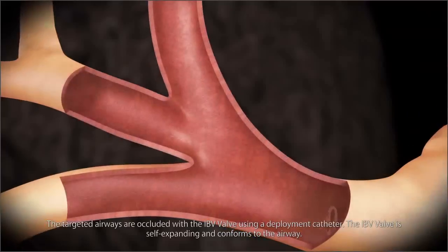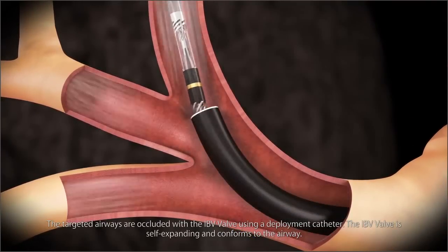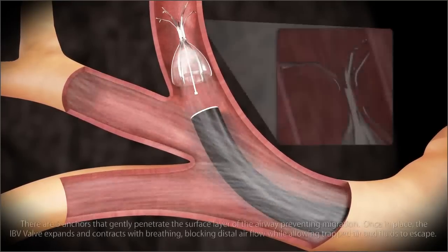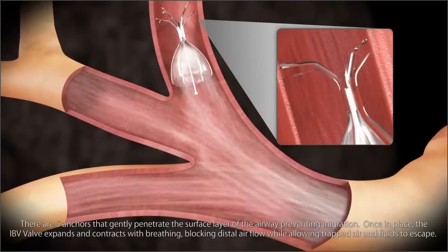The targeted airways are occluded with the IBV valve using a deployment catheter. The IBV valve is self-expanding and conforms to the airway. There are five anchors that gently penetrate the surface layer of the airway, preventing migration.